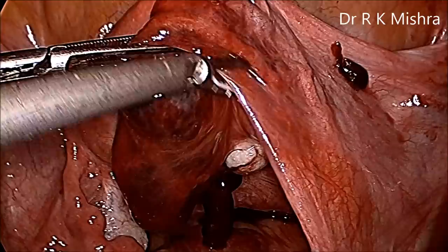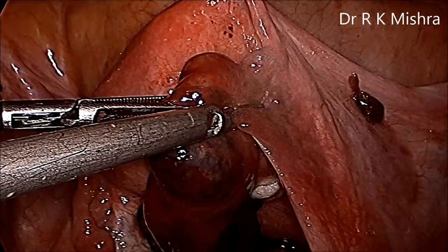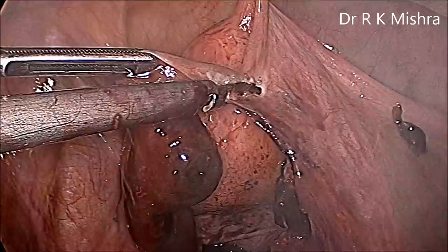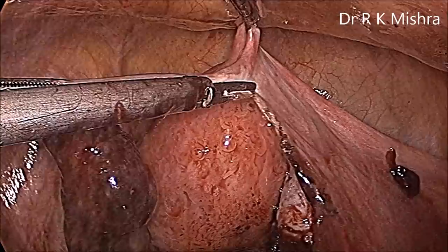Here is the infundibulopelvic-ovarian ligament, and keeping the harmonic as near as possible to the tube, the salpingectomy is started from lateral to medial. Salpingectomy is a very easy procedure and it is required in the case of ruptured ectopic. The ectopic was in the ampullary region, so we can see the clot and there is trophoblast inside.